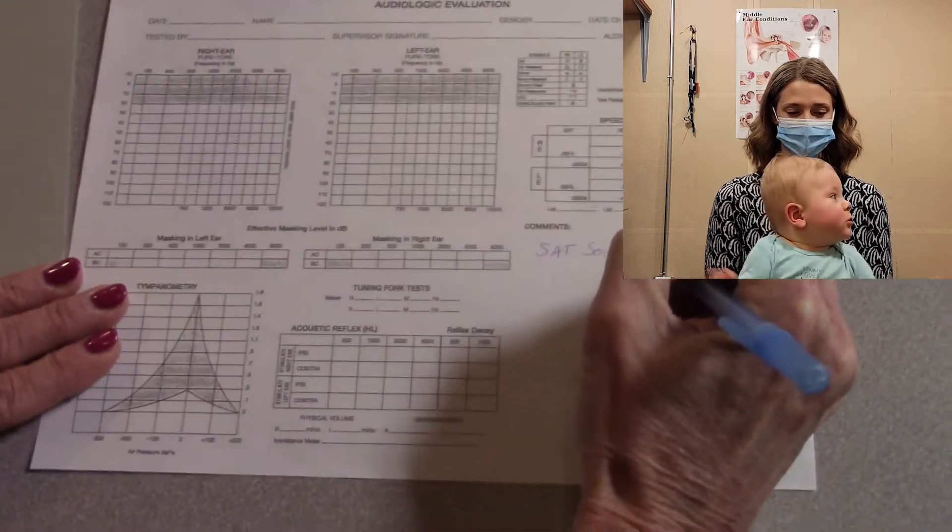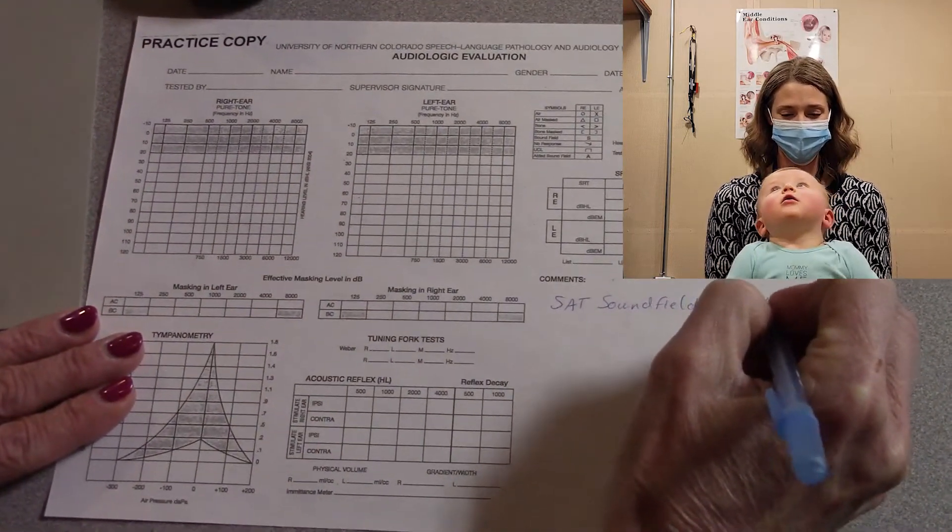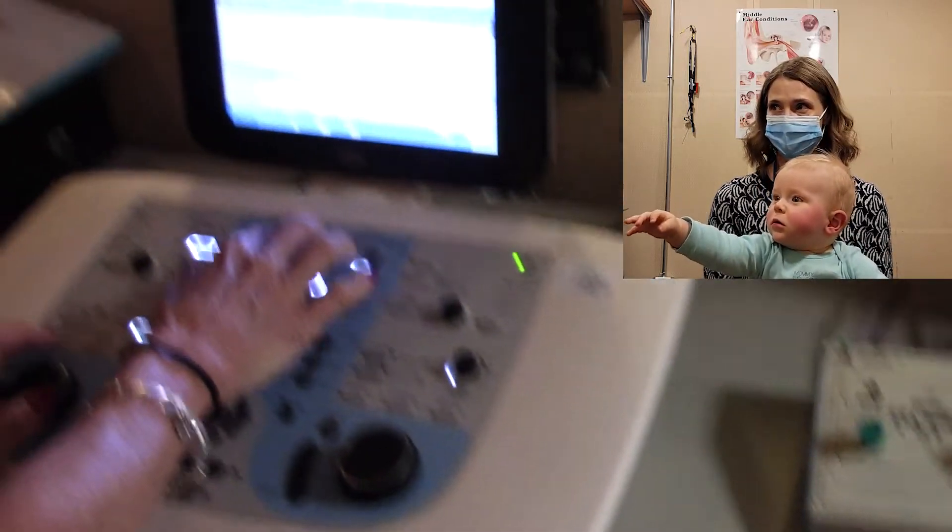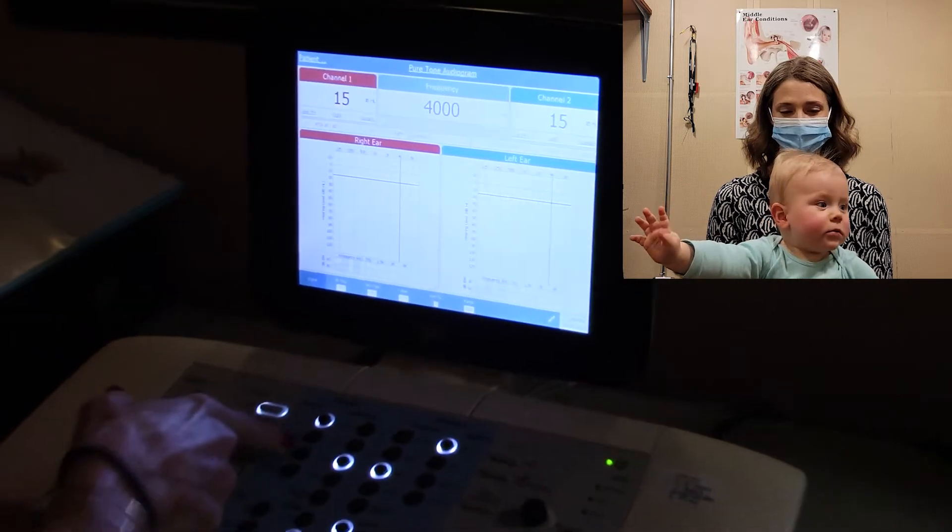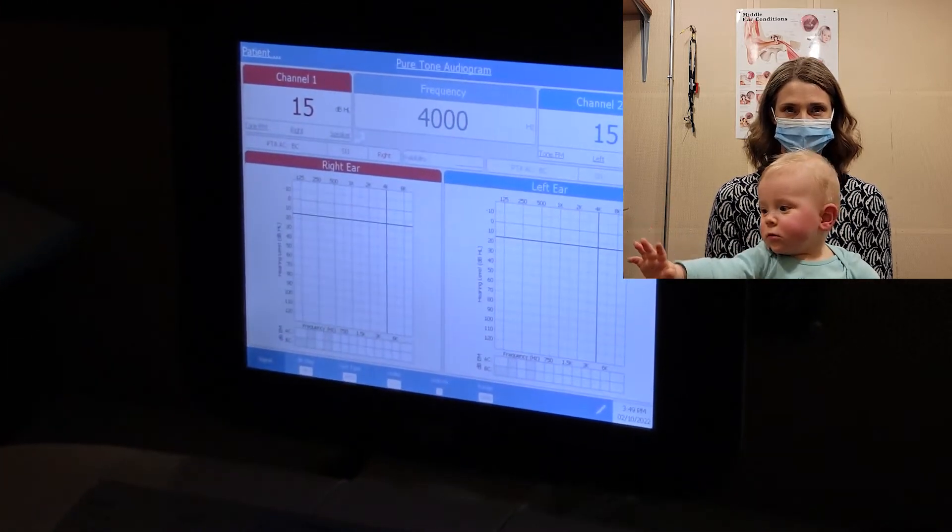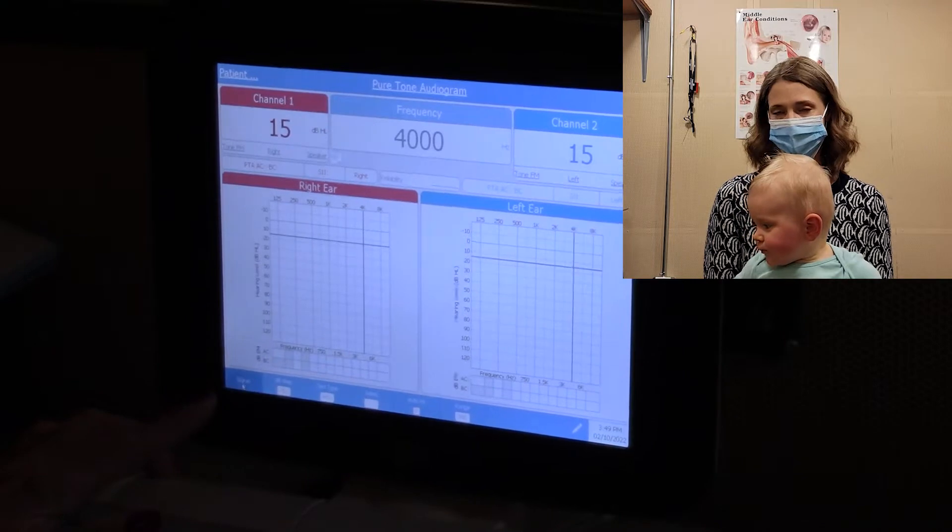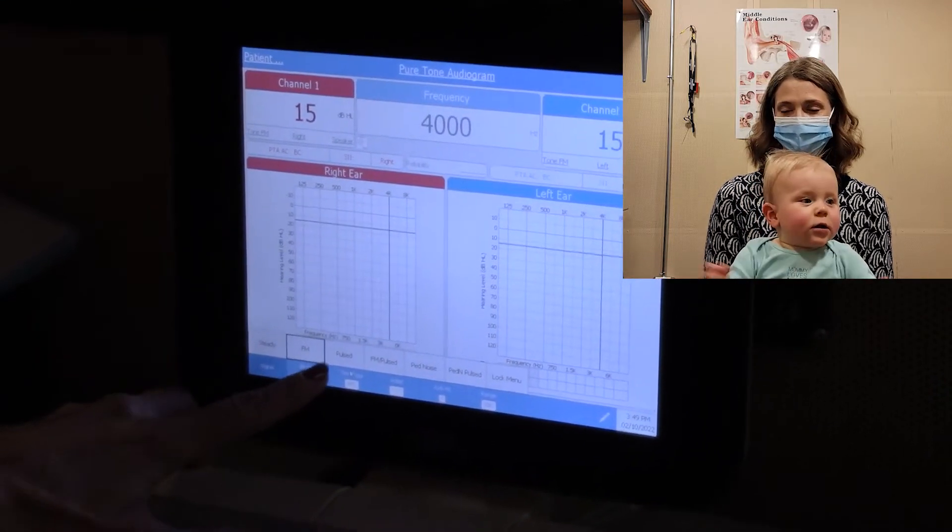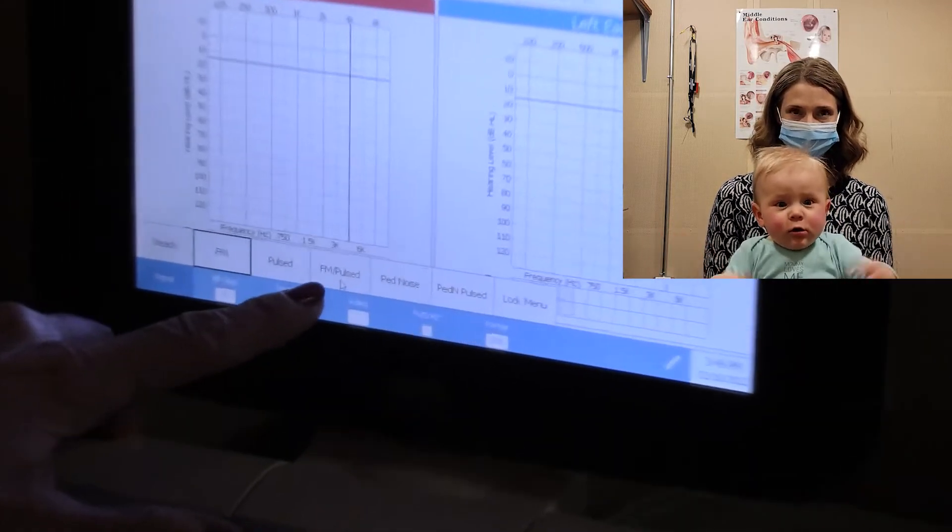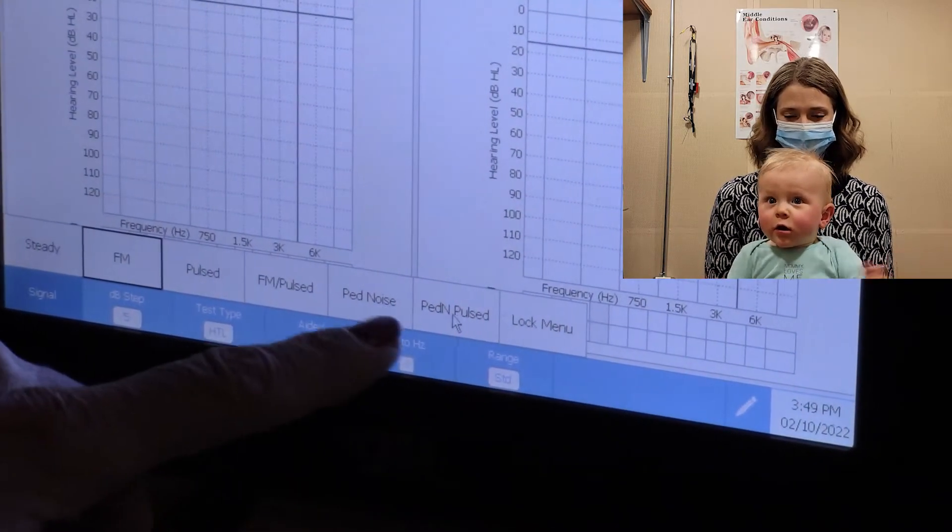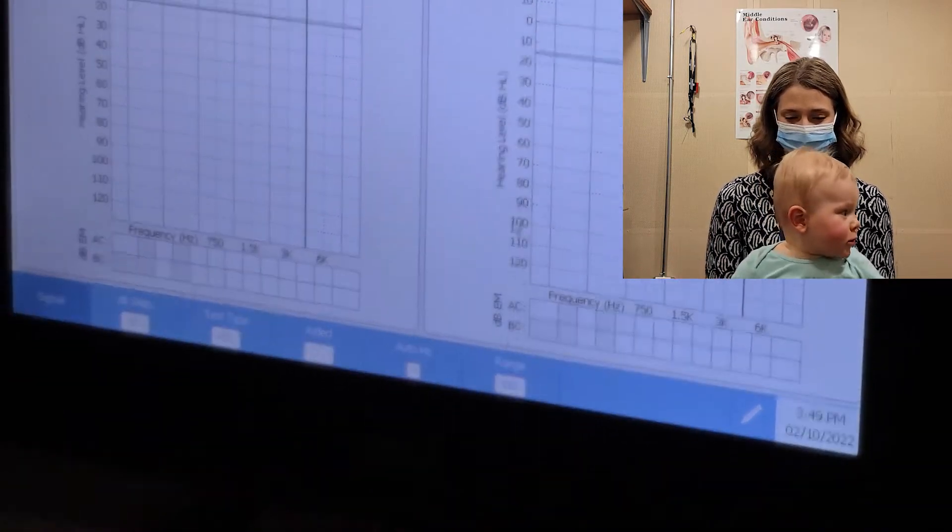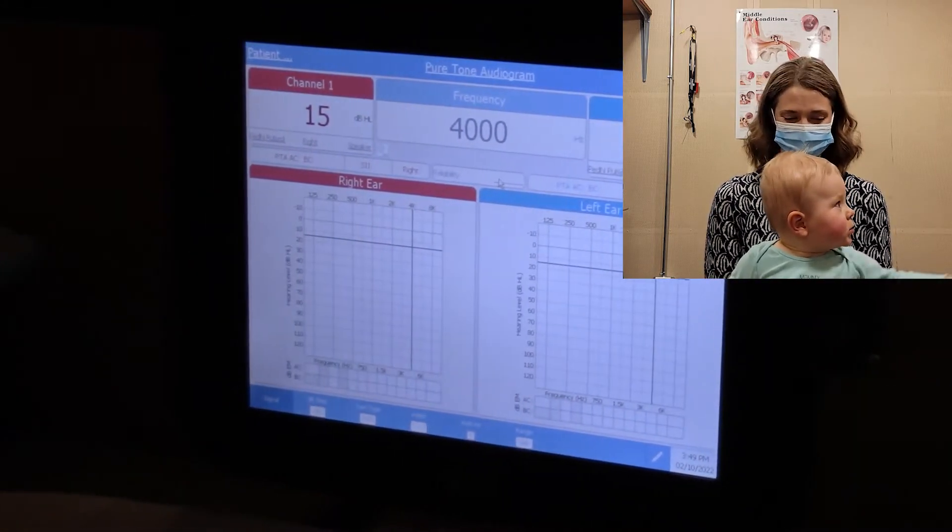Soundfield. 10 dB HL. Now, we're going to present tone. So, we've got tone there going out of the speaker. Our choices are when I take the signal. We've got FM, which is warble. Pulsed. FM pulsed. We've got peds noise and pulse peds noise. We're going to take pulse peds noise. We're going to go to 2,000.